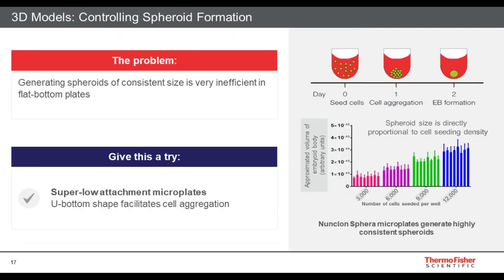This is meant to illustrate the last line, that traditionally, when I first started culturing stem cells or forming embryoid bodies from stem cells many years ago, one of the ways in which it was commonly done, partly because it was cheap and somewhat effective, was simply to culture cells in static culture, but in vessels that were non-adherent, so that cells would not attach.